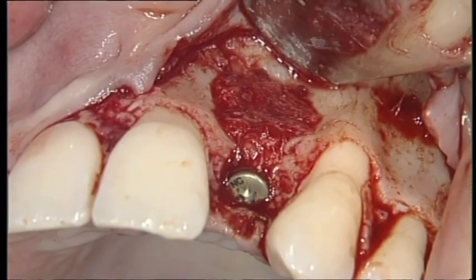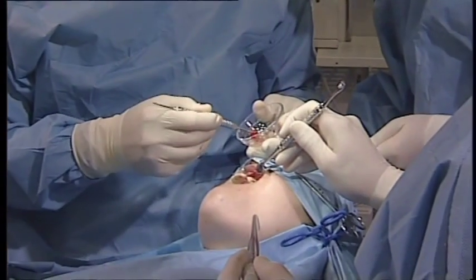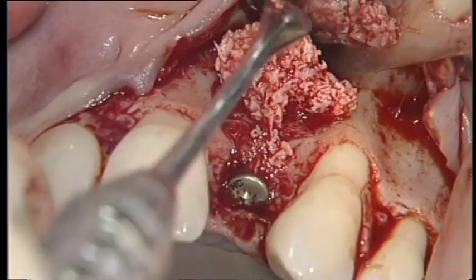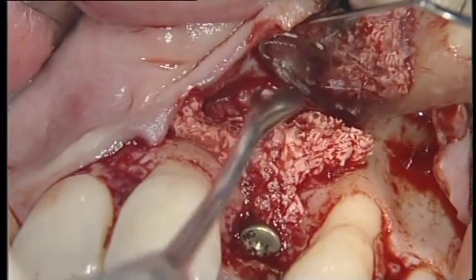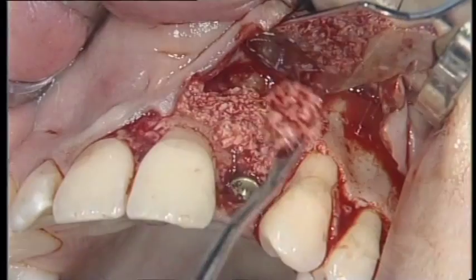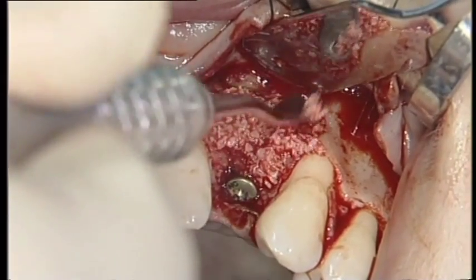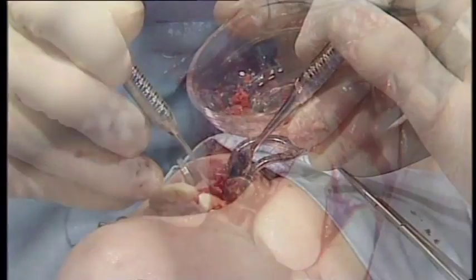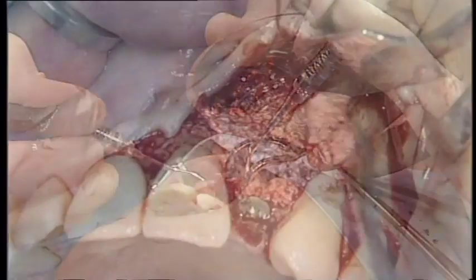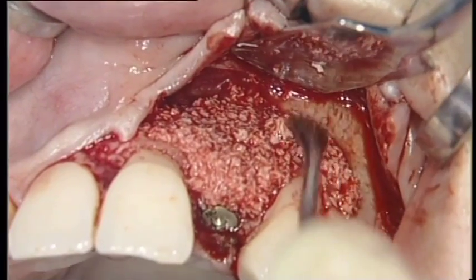The combination of autografts and implants with an SL active surface has led to a general reduction of healing periods for GBR procedures in the past 2 years, since both accelerate new bone formation during initial wound healing. The applied autografts are covered with a layer of bio-os granules for contour augmentation. Small particle granules are used, as usual in aesthetic sites. Additional bio-os granules are applied at the implant site and around the canine root.